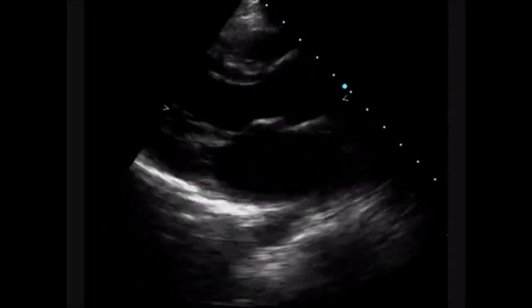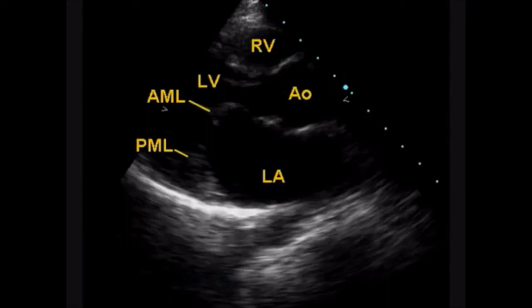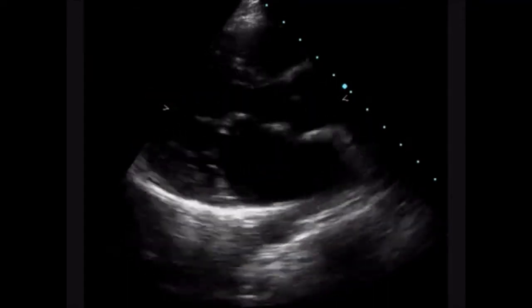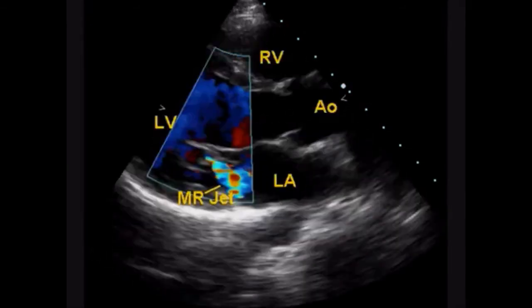Here I am demonstrating a post balloon mitral valvulotomy echocardiogram. This is the parasternal long axis view showing the anterior and posterior mitral leaflets.